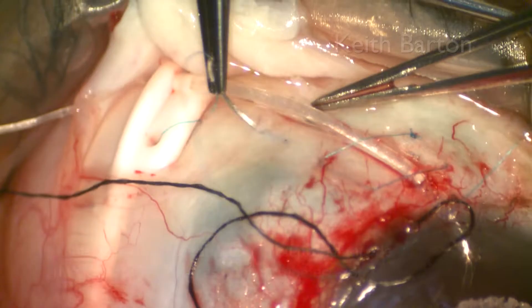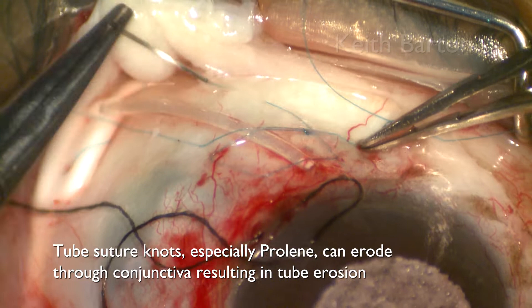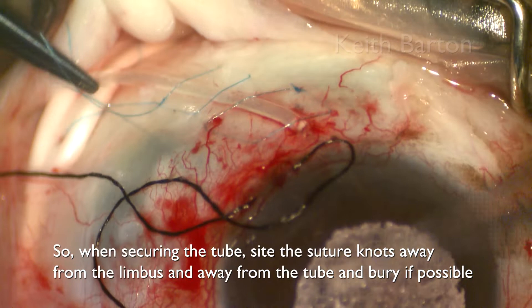Tube suture knots, especially prolene, can erode through conjunctiva, resulting in tube erosion. So when securing the tube, site the suture knots away from the limbus and away from the tube, and bury them if possible.